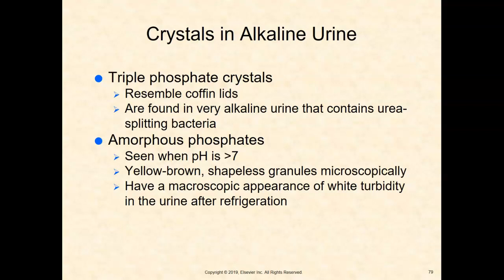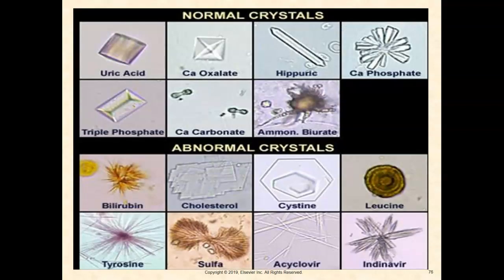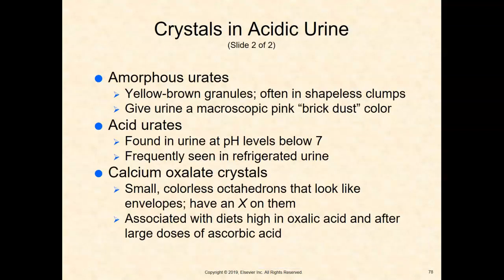So I've seen these in older urines per se. So usually you don't find this in a nice fresh urine. They do look like the top of a coffin. I'll go back up so you can see right here. Okay, this one. See how it kind of looks like the top of a coffin from the ceiling down? Kind of looks like that.